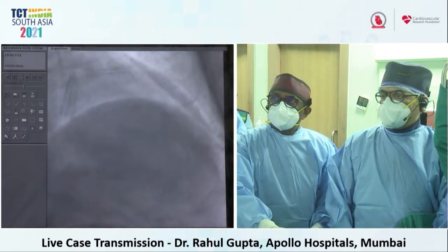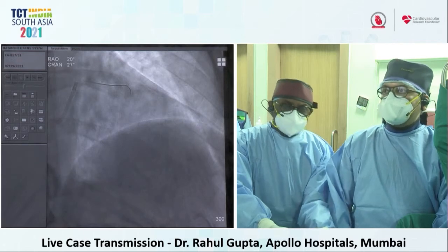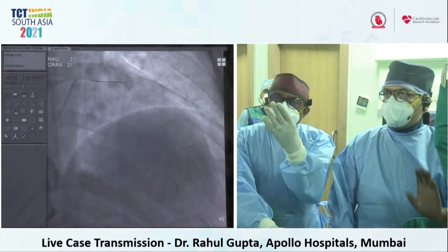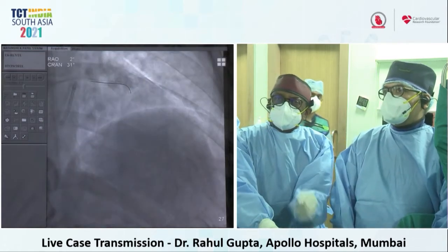So I think the camera probably was not able to focus on the hand. On the radial portion of the hand, there is only now the guide. There is only the guide, and the patient is quite comfortable. He's busy, so, with that.